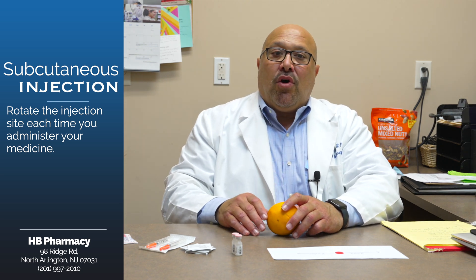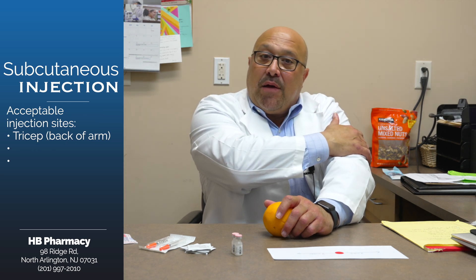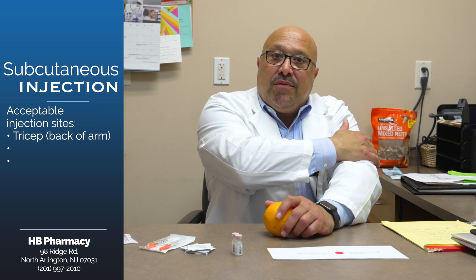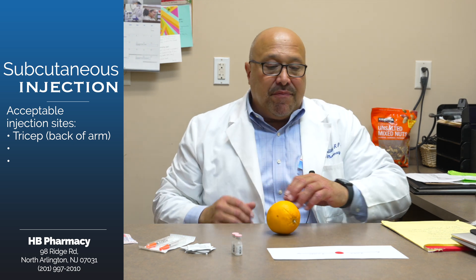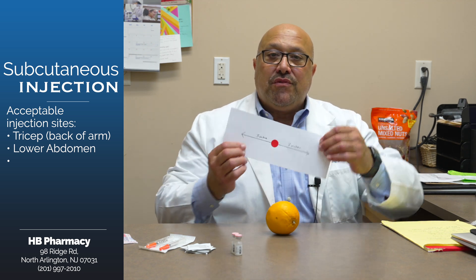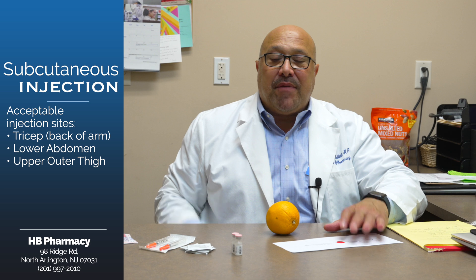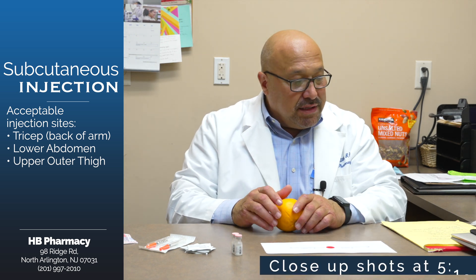The sites that are acceptable are the back of your arm, which is your tricep — that would have to be somebody else administering it to you, but it is a good site. The lower abdomen, two or three inches away from your belly button on either side, or your upper outer thigh area. We'll get some shots later to show you exactly how that looks.